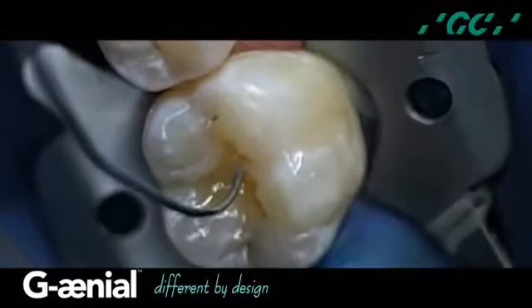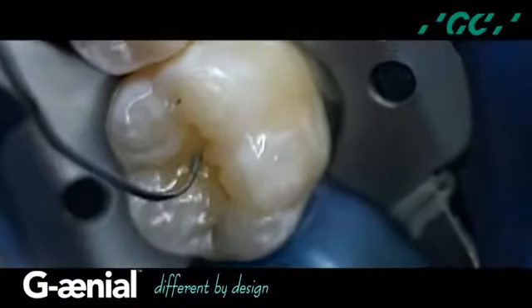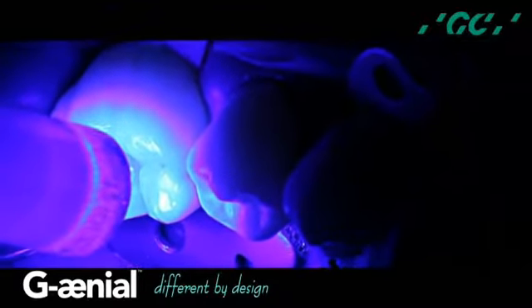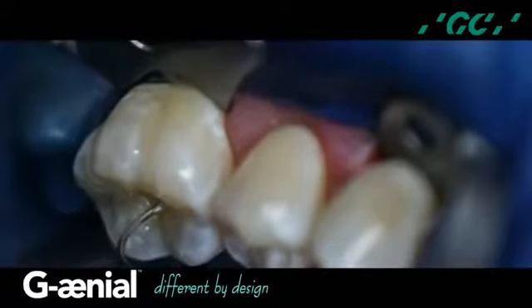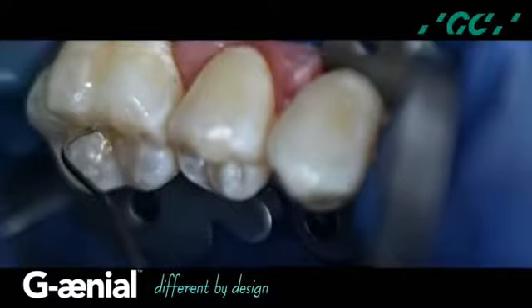Notice as I make the ridges, inclines, and planes, the material is easy to manipulate and sculpt, and each time I stabilize by light curing for 10 seconds. I continue to develop the anatomical form, placing increments of flowable and shape with an explorer tip.